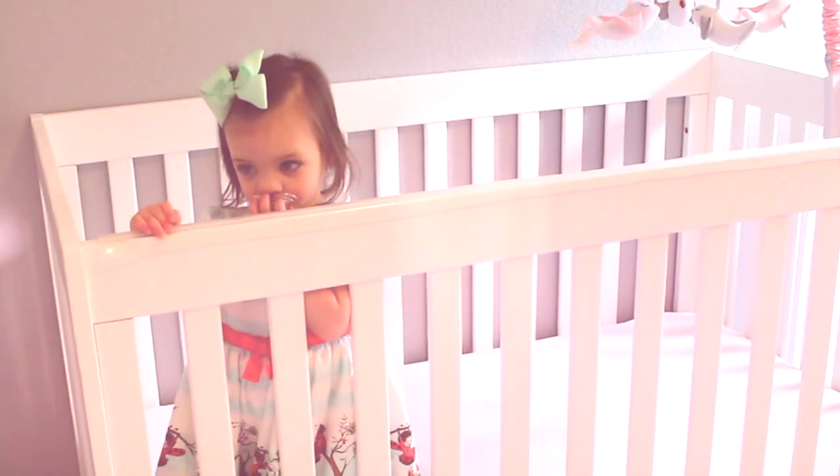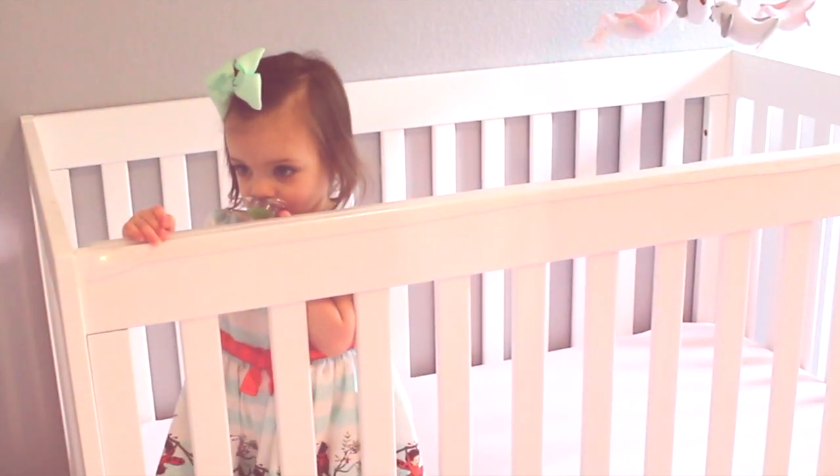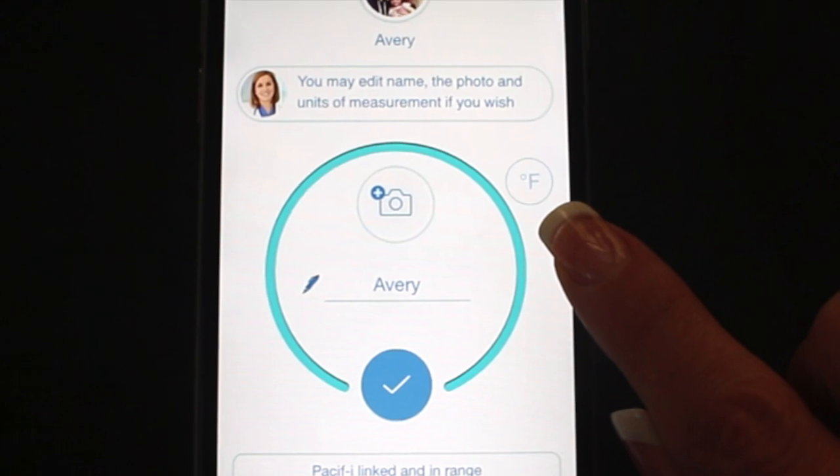Pacify does read temperatures in Celsius automatically, so you do have to change it to Fahrenheit if that's how you want the temperature read.